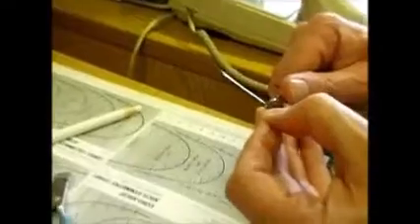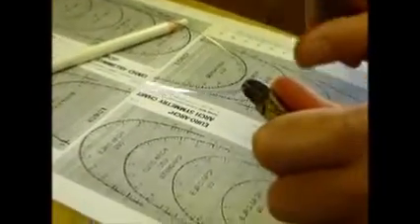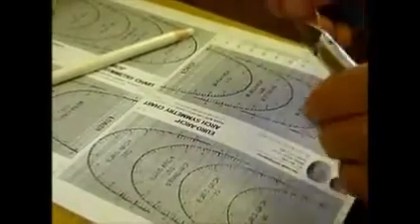I mean, looking at that, doing that from here, it looks really difficult. Well, I don't know whether it is, because it's a bend that clinically doesn't take very long. It usually takes a couple of minutes to put in a little bit of torque, and so you try and get both these sides to be flat, more or less flat.